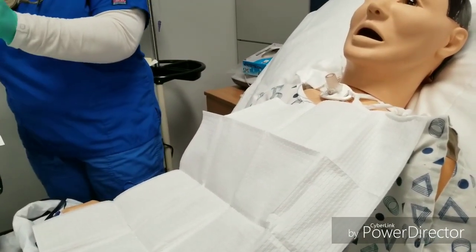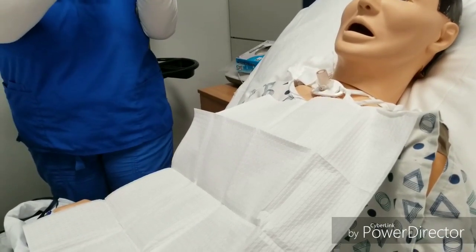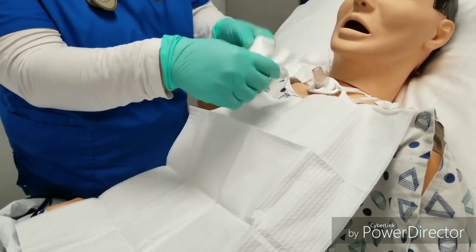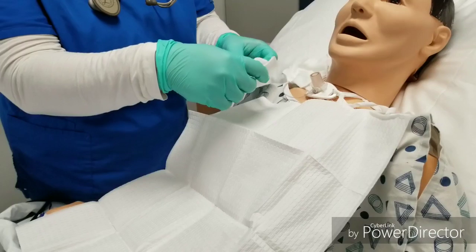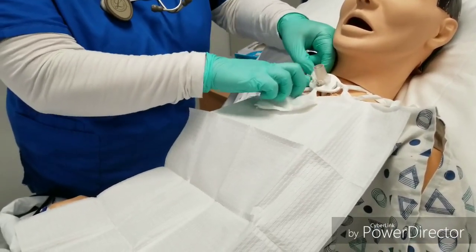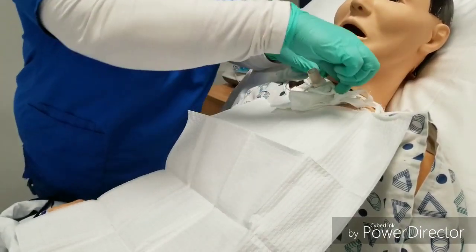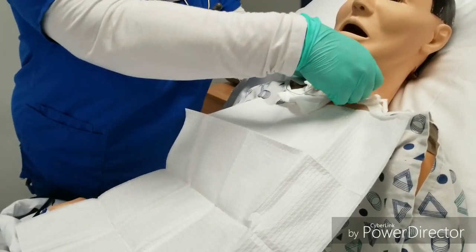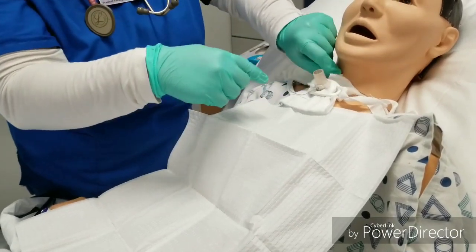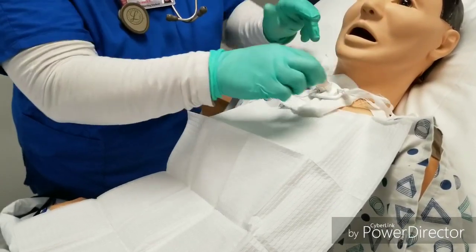So this is your dressing for your trach. Now we're going to try to keep that middle part as sterile as possible, and it's going to open up to keep this bottom part as dry. And this part is not sterile because you just can't do it without touching the patient and touching all of this. But you want to try to keep that part that's going to touch the stoma and around the trach as sterile as you possibly can.